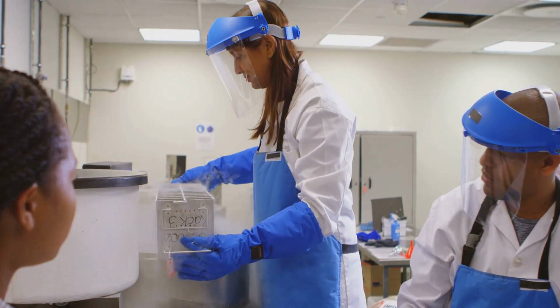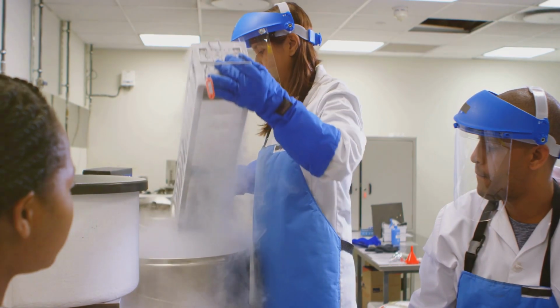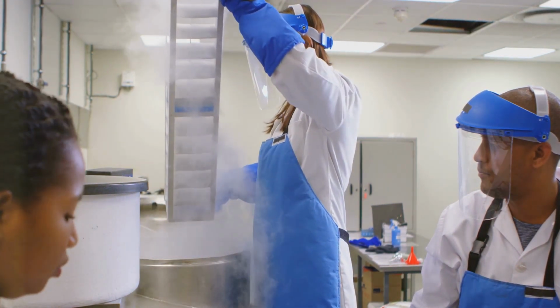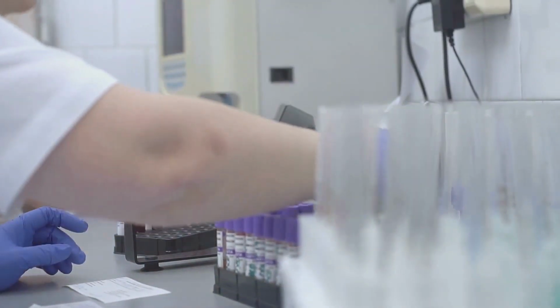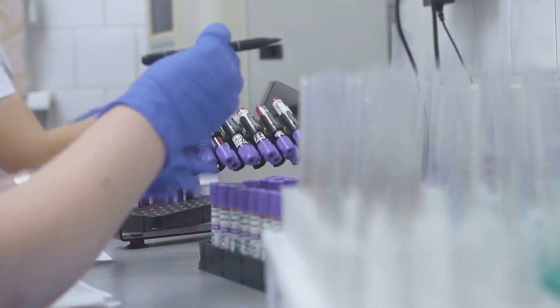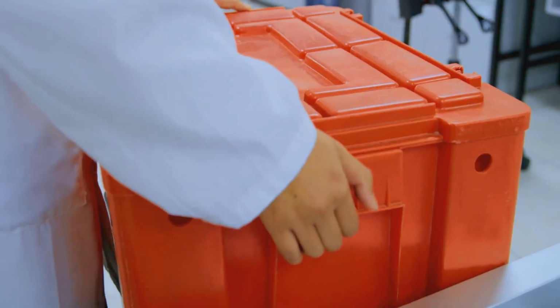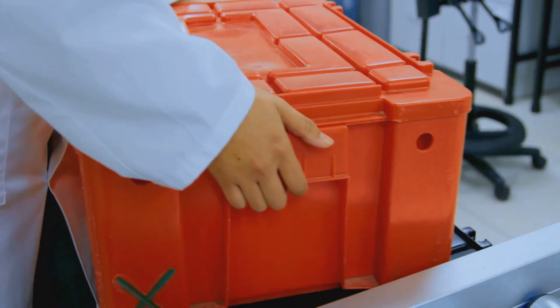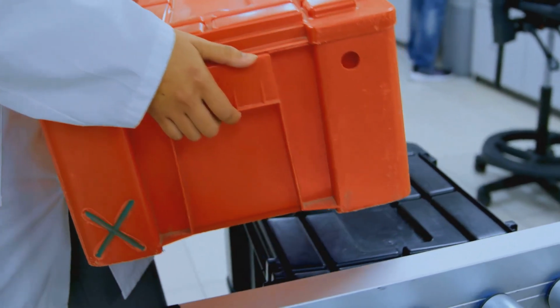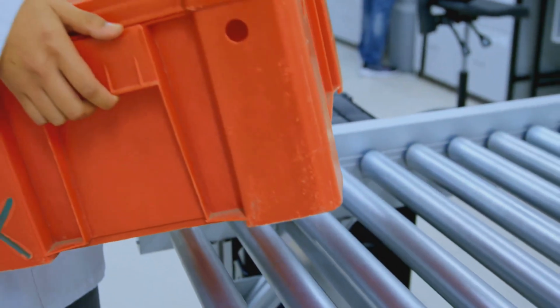One of the primary concerns during transport is maintaining the appropriate temperature, as it can significantly impact the sample's condition. Some samples, such as blood cultures or certain hormones, are highly sensitive to temperature fluctuations. Even minor changes can affect their stability. The standard stresses the importance of using temperature-controlled containers and transport boxes to preserve sample integrity. This ensures that samples remain viable for testing.